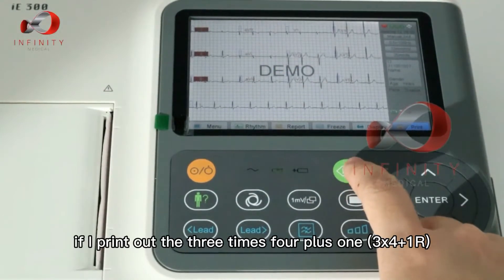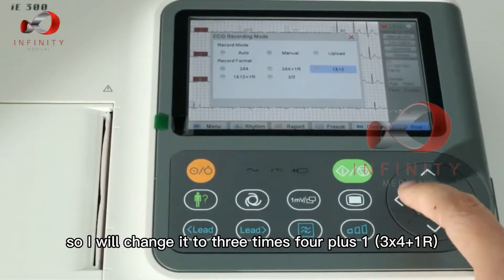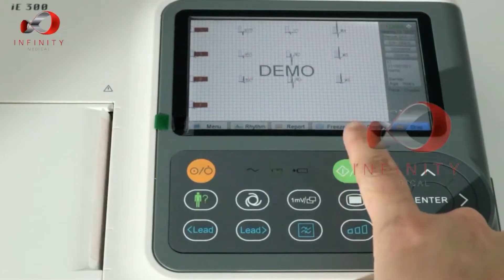For example, if I print out three times four plus one rhythm, I change it to three times four plus one and press print.